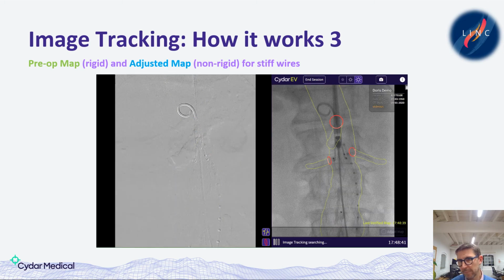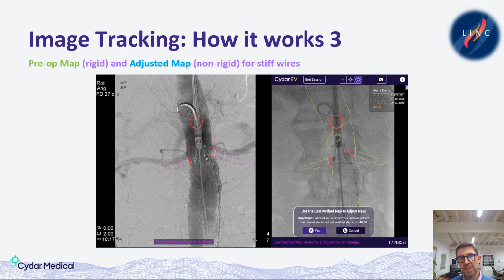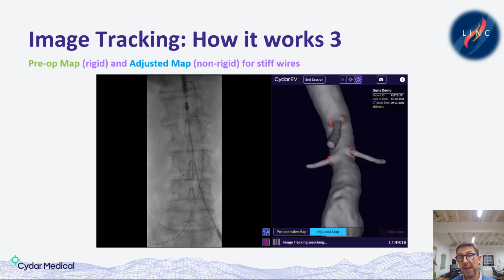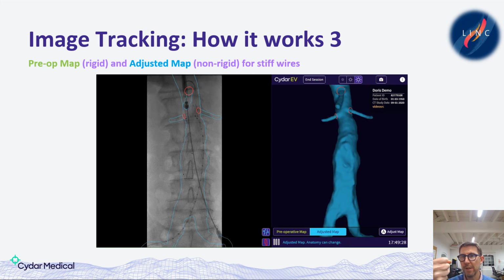With this, you can either see it from the position of the wires or you can see it on a DSA. So the DSA comes in, and when you have a look at the map, it doesn't match up. We're expecting that because there's a delivery system in there, but you can now just adjust that 3D map. You use a remote control, it's a few clicks. Non-rigid, remember, it's like bending a plasticine model. So you probably adjust here on the renals. The renals always seem to move upwards with infrarenal stiff wires. But you can now move the suprarenal aorta in one direction, and the infrarenal aorta in another direction, and just make it update. It doesn't matter what perspective you're looking from. You can come to a different field of view, a different angle, but it remembers that updated anatomy. So you now have that essentially as your reference for the real-time anatomy.